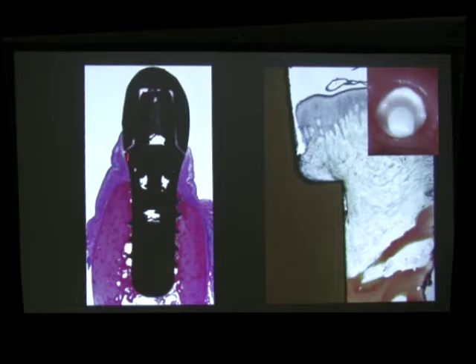Because of that, the industry took the margin of the titanium implants to the bone level, so any resorption would not be 1 year post-op, it would be maybe 5 to 10 years post-op. And this is not good because all the systems, and when I say all, it means all, have microleakage. Microleakage means that bacteria grow inside these connections. And I don't know how many of you have unscrewed titanium implant components, but when you unscrew them and leave them on top of the table, they produce a very strong smell, and this is all the time inside the mouth. And no matter how well you brush your implants, even if you're a dentist, they will smell too.